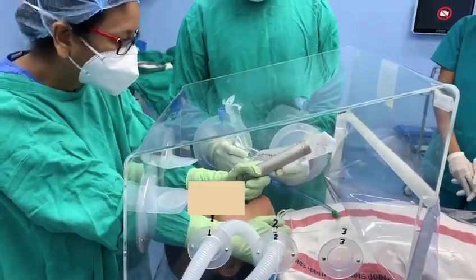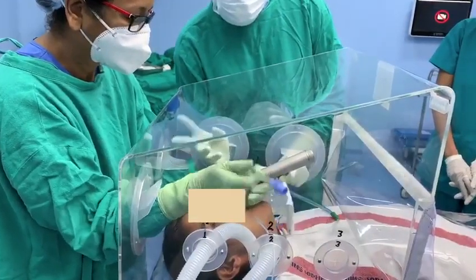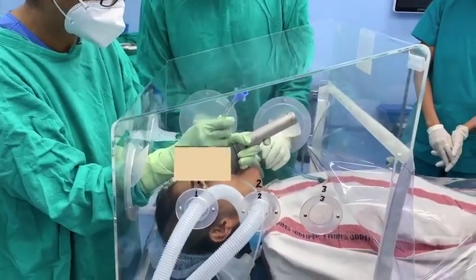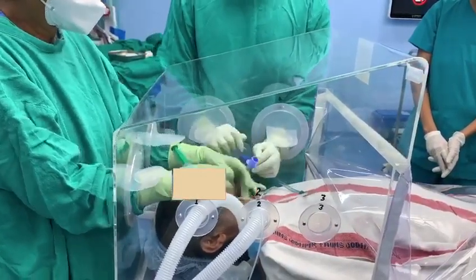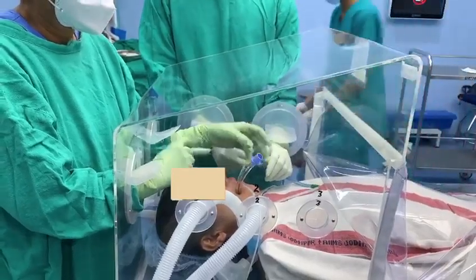All four ports are self-sealable and provide enough movement of the hands while doing any procedure. There are multiple small ports on both side walls for various cables and tubings like suction tube, ventilatory circuits, video laryngoscope cables, etc. These ports are also self-sealable with enough stability.